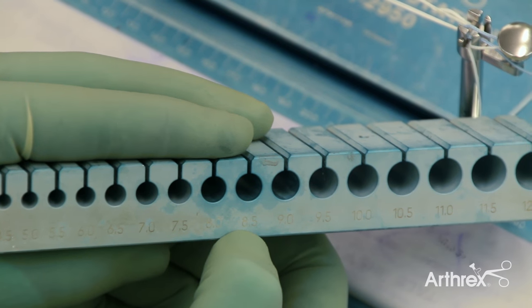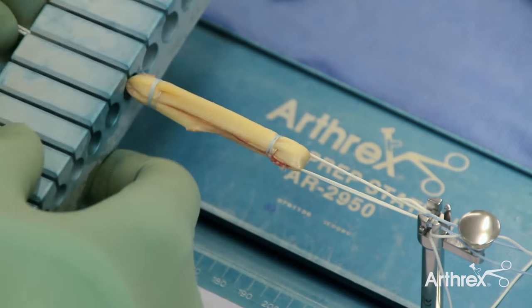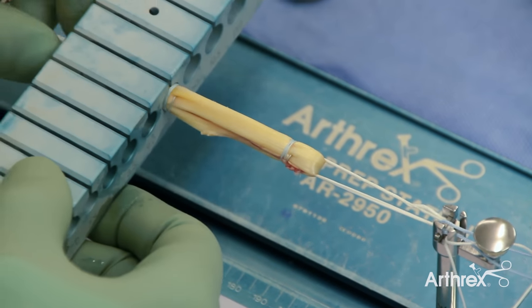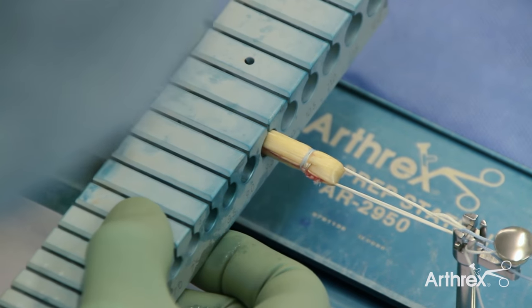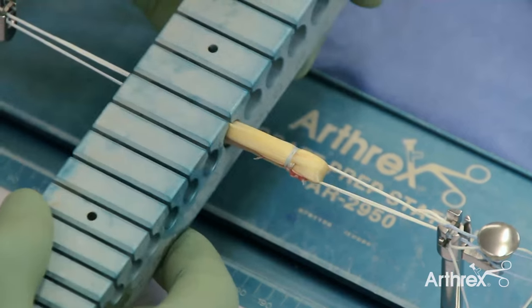We then use the sizing block. Nine can be seen to be a little tight, but the graft link is seen to be passing through the 9.5mm sizing slot. So for this case, we will need to use a 9.5mm flip cutter.